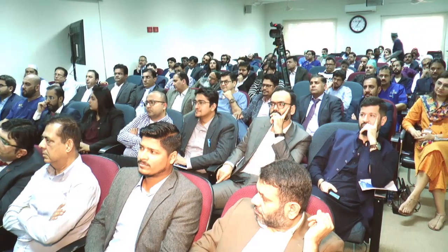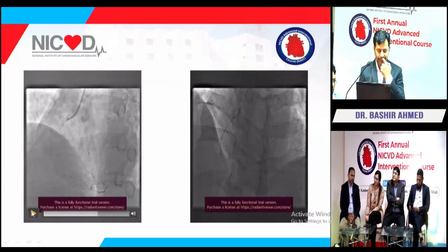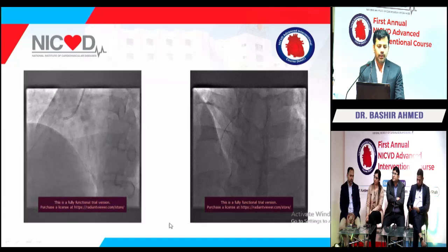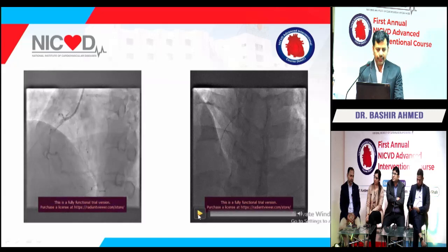So here we tried RCA first, with the antegrade wire escalation technique, with the support of a microcatheter, and wired the RCA. Dual injection was not taken as a primary because the patient had the issue of contrast-induced nephropathy.